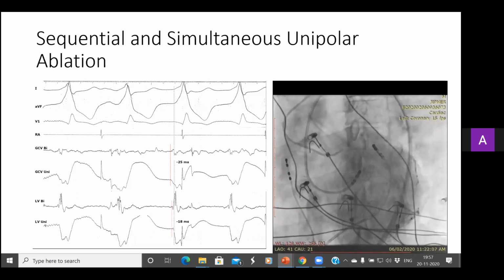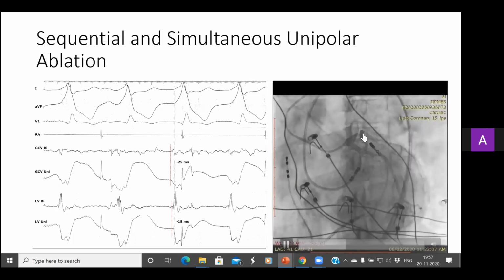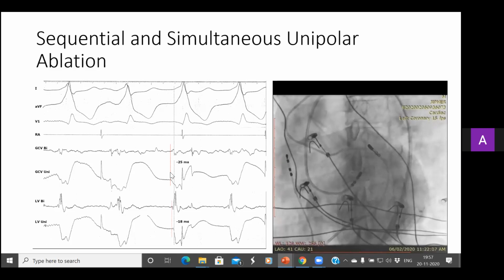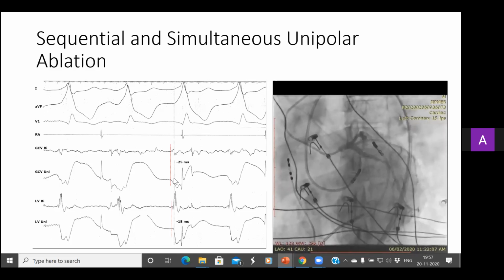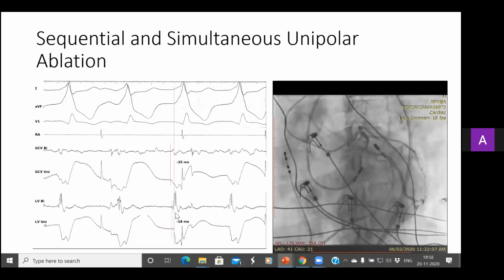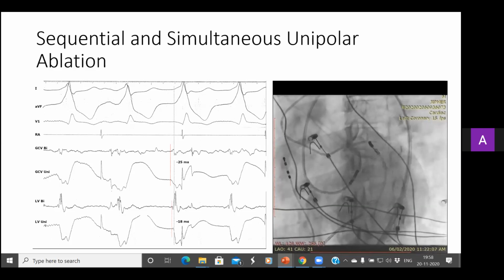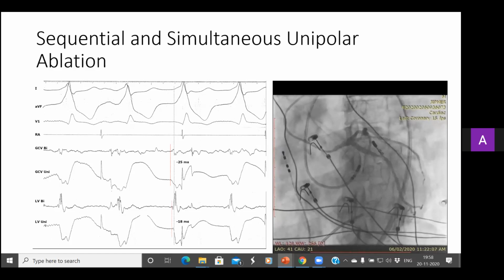We finally attempted simultaneous unipolar ablation from the distal GCV and the LVOT endocardium. At the site we ablated inside the distal GCV, we had early activation by at least 25 milliseconds with a good QS unipolar. And at the LV endocardium, the ablated site was, as already mentioned, 18 milliseconds earlier. Unipolar ablation was done with 2 separate RF generators, with power up to 50 watts inside the LV endocardium and 30 watts in the distal GCV, given for 1 minute. With this, the patient had a complete sustained elimination of PVCs.